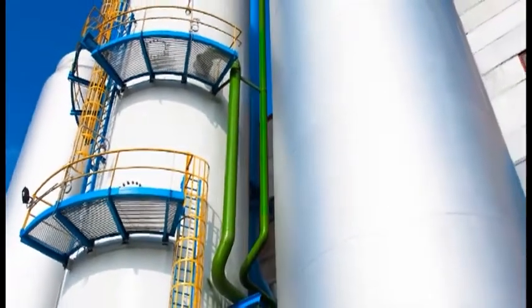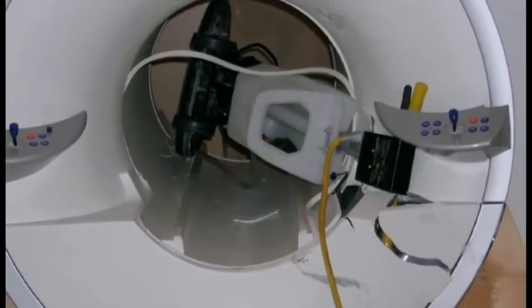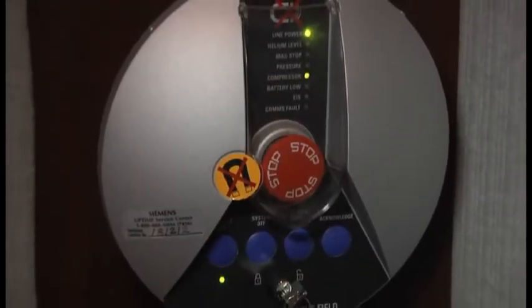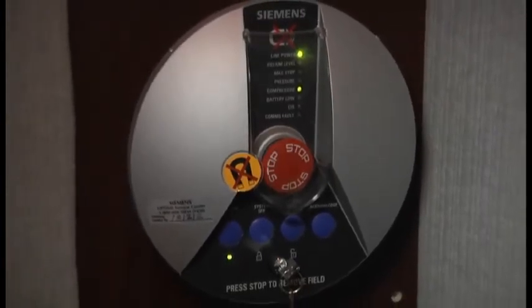Due to the enormous expense of cryogen gases and the hazards created when cryogen gases are expelled, the only time a magnet is usually quenched is if a large metallic object pins or impales a person and there is no other method to prevent further injury or free the person. There is a possibility of an uncontrolled quench, which happens automatically due to a component failure or malfunction. At most facilities, the only person who can authorize the pushing of one of these two buttons would be the MRI technologist or the radiology manager. This can be a $40,000 expense.